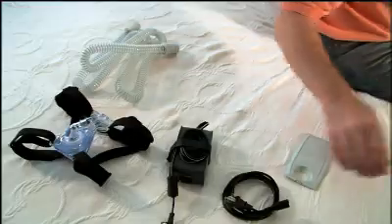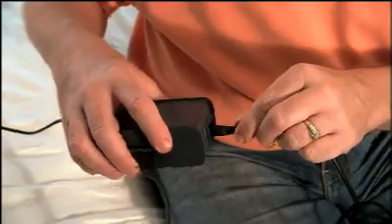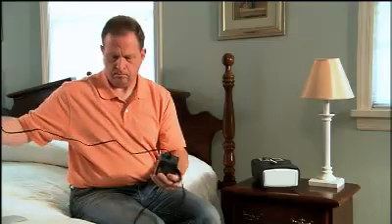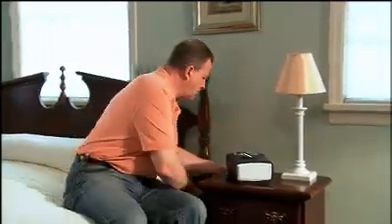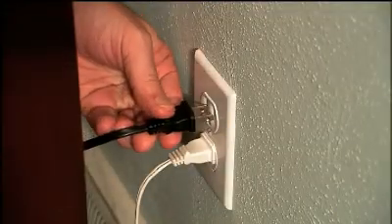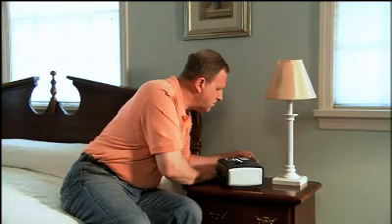To activate both the System 1 device and the humidifier, plug the socket end of the AC power cord into the power supply. Plug the power supply cord connector into the power inlet on the back of the device. Plug the pronged end into an electrical outlet. Don't use an outlet that's controlled by a wall switch. The device should now have power.